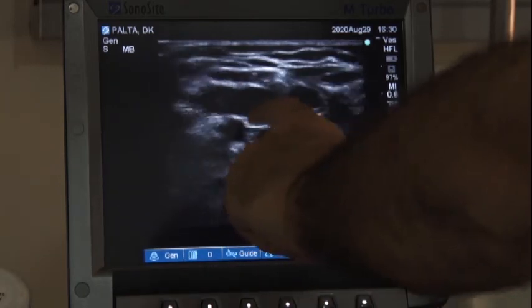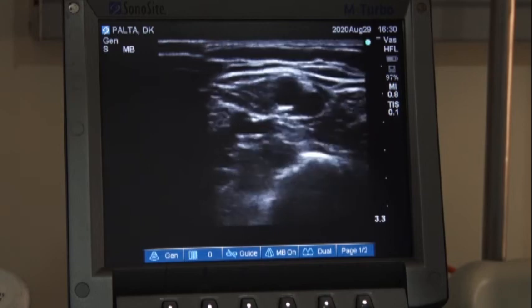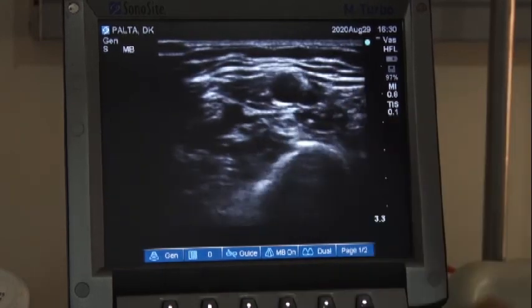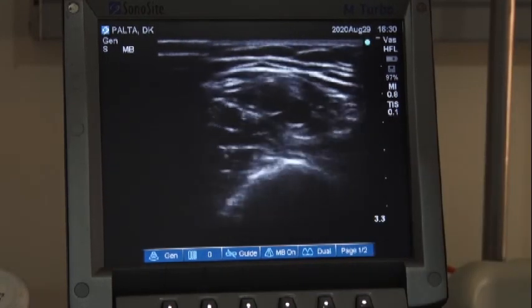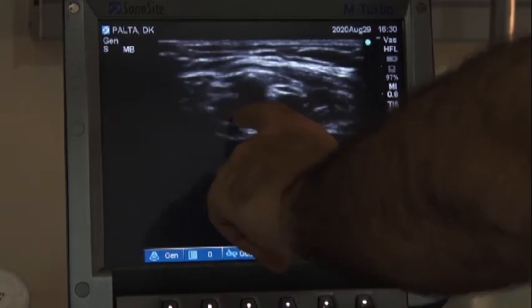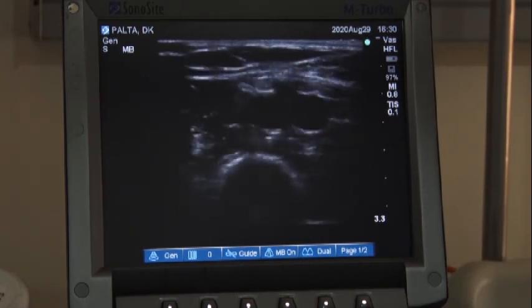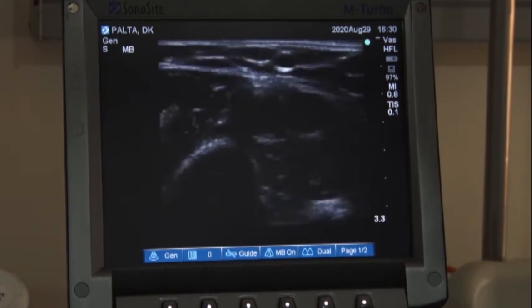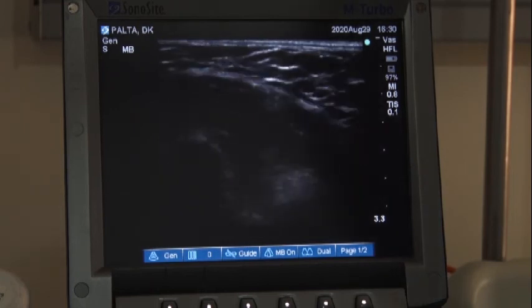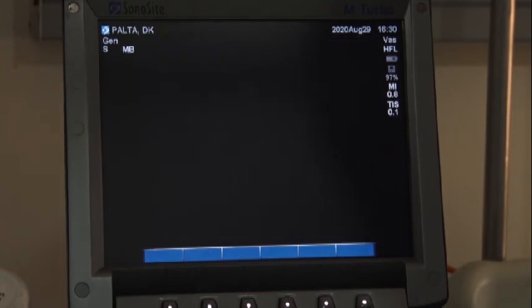This is the brachial artery, this is the basilic vein. Now this vein is running along the brachial artery as a vena comitans. Now this vein is again joined by the vena comitans of the brachial artery, and I have reached almost to the axilla, and it's continuing as the axillary vein. See now the flow here.